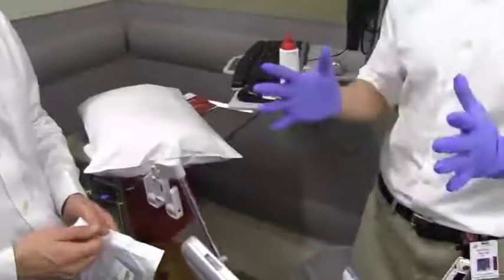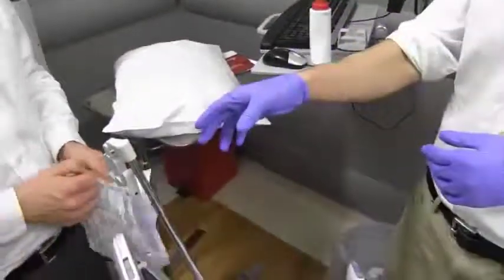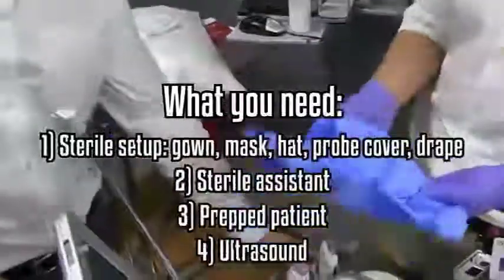This is One Minute Ultrasound for sterile technique of central line placement. First, you'll want to have yourself completely gowned and prepared. Then you'll want your assistant to hand you your probe cover.